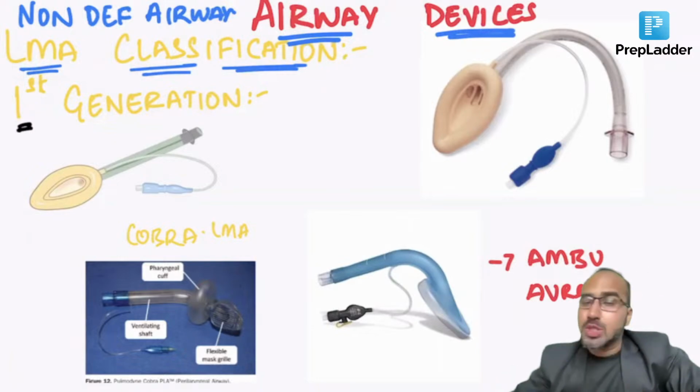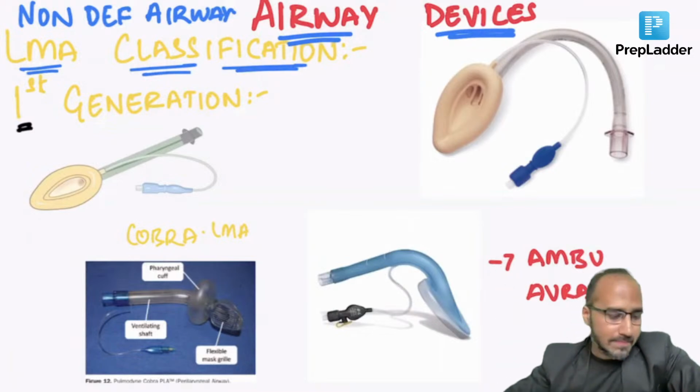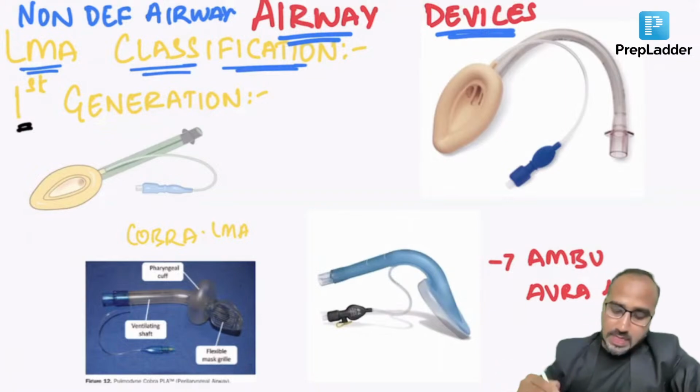How you can block means you are just blocking one end. There are two openings in the combi tube, right? If you are in the trachea, you will know, you can ventilate through the other opening, the one for the trachea. Right. Just look over here.